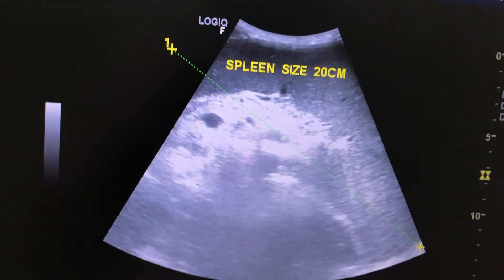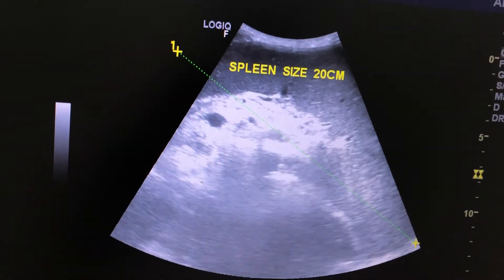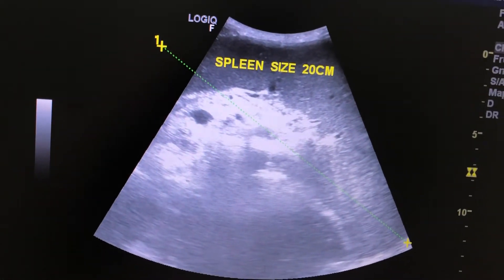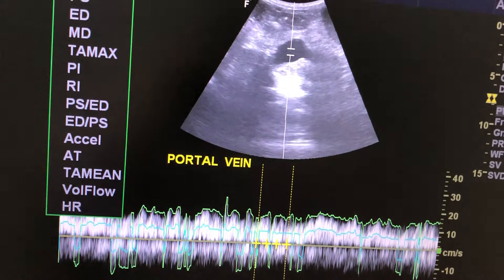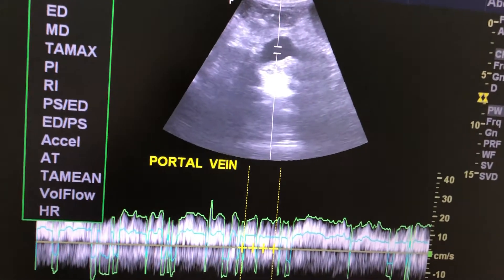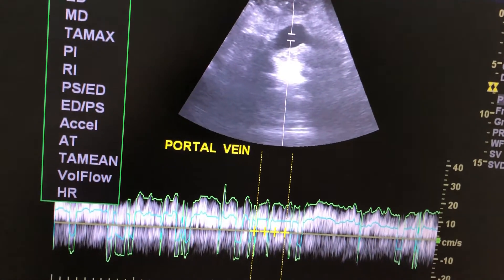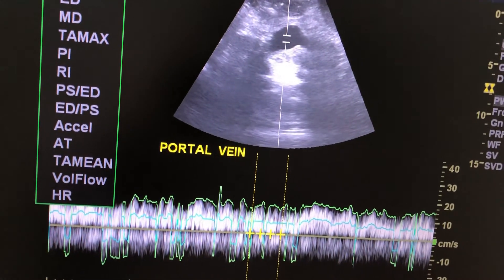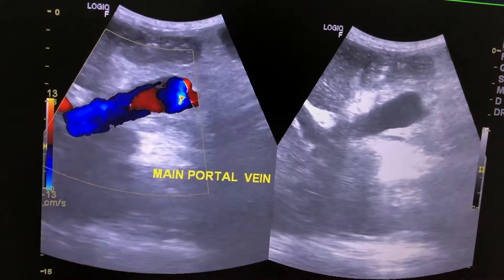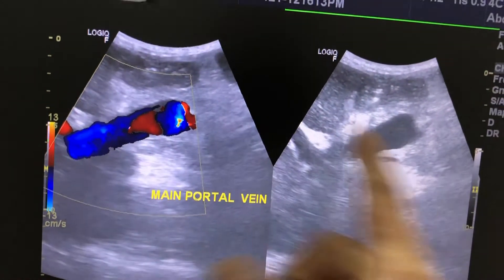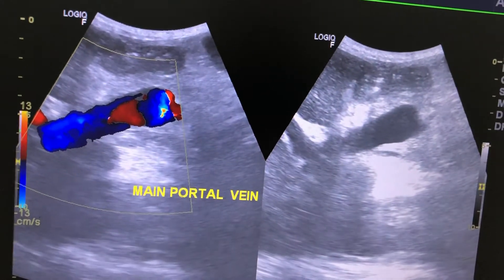The spleen was 20 centimeters in long axis with normal texture. This is the waveform of the portal vein, which is normal. The flow is also normal.